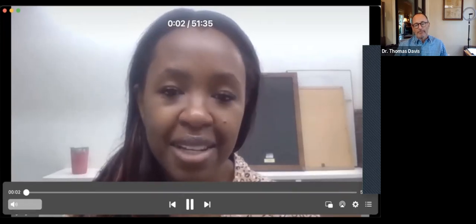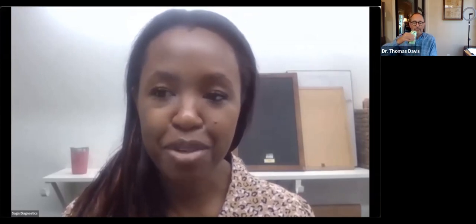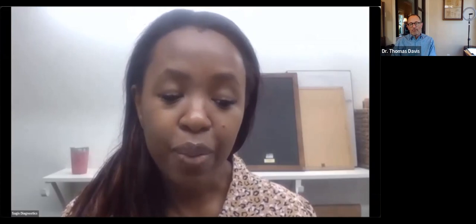Thank you, Dr. Davis. As mentioned, I'm Dr. Maloney, and today I'm going to be reviewing viral infections, which I think is certainly a good moment in history to do so.